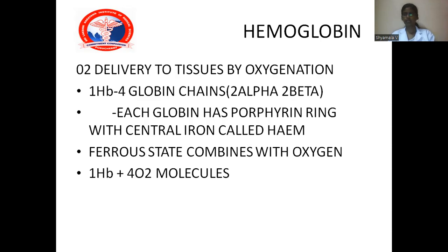We all know that during anesthesia, the patient's airway may become compromised or obstructed, the breathing may be depressed, the circulation may be affected by blood clots or an abnormal rhythm, or anesthetic equipment may develop problems such as accidental disconnection or obstruction of the breathing system circuit. All this can result in reduced delivery of oxygen to the patient, which if not managed properly can lead to injury or death. So the anesthetic provider must detect these problems early. The sooner these problems get treated, the less harm to the patient.